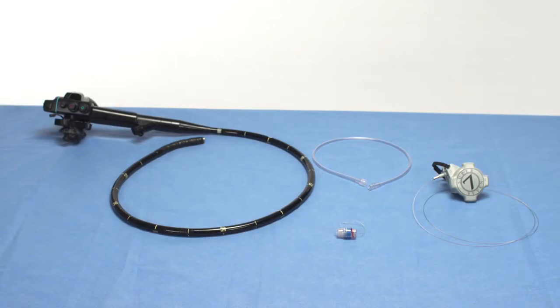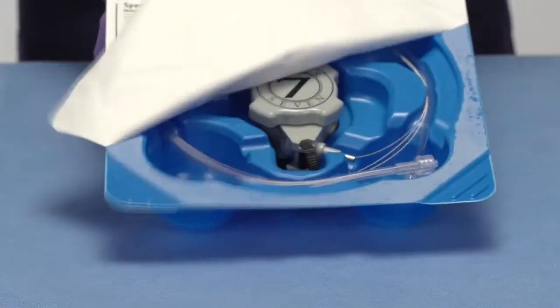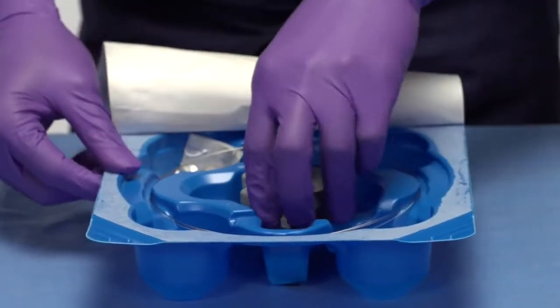The first step will be to attach the handle unit to the endoscope. Remove the device from the package. Pull back the cover and remove the plastic irrigation tubing and the handle unit and tripwire.